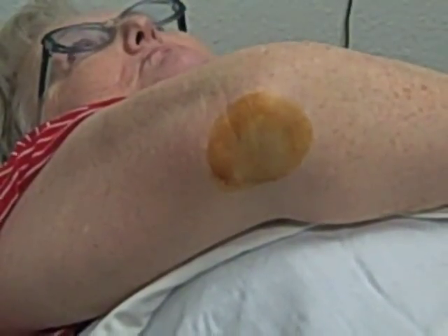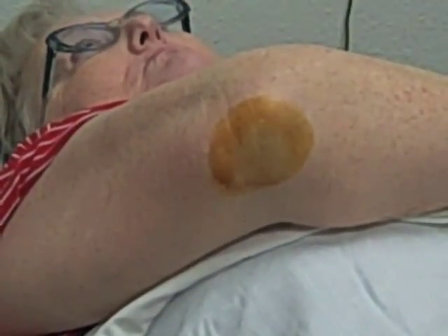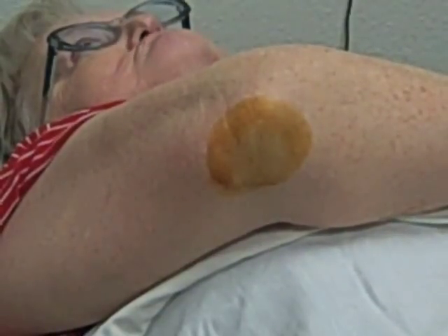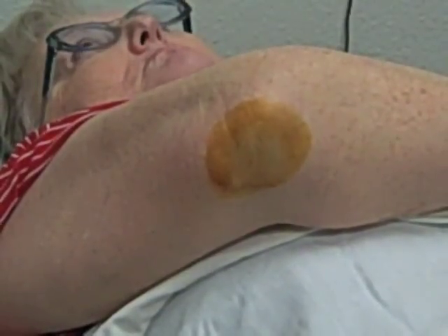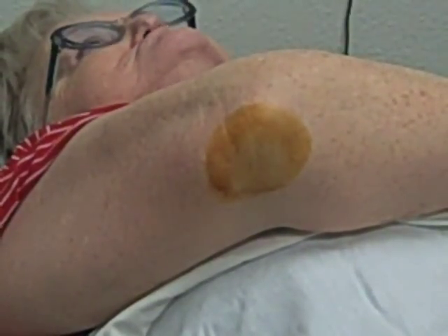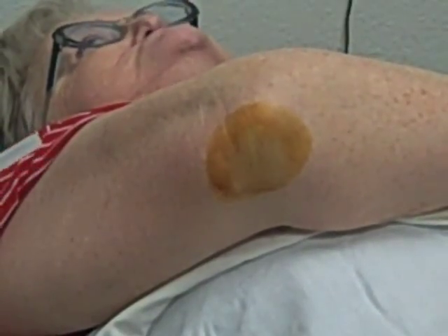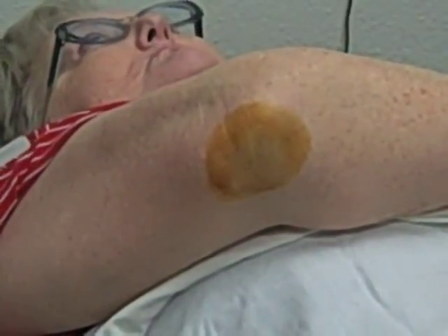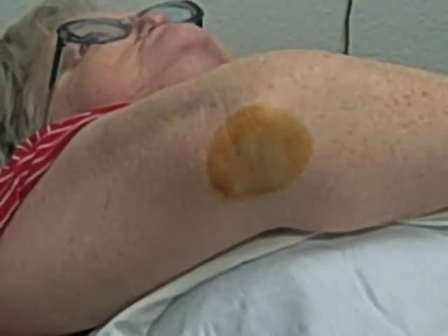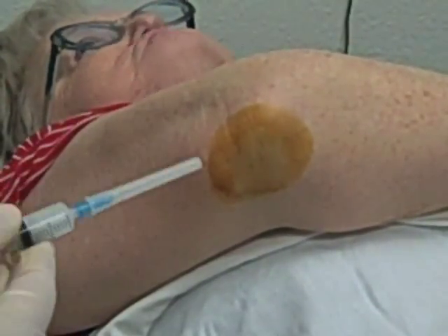The risks and benefits of the procedure have been reviewed with the patient and the proper consents have been signed. Today we're going to be demonstrating a posterior medial approach. The patient is supine with the elbow flexed at 90 degrees.